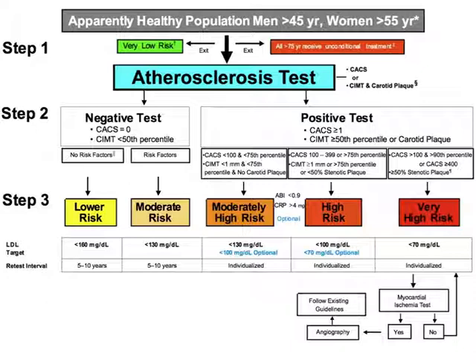But now that the machines are in the clinician's hands, if you're going into primary care, this is another great potential use. You can use it to risk stratify your patients and help direct therapy. So that's the idea going on with this.